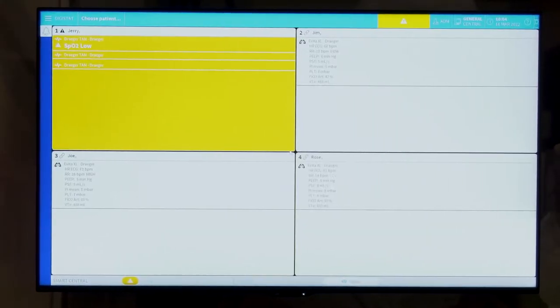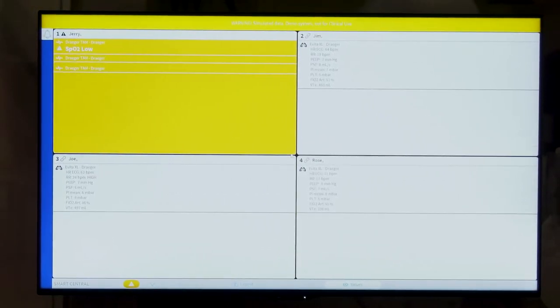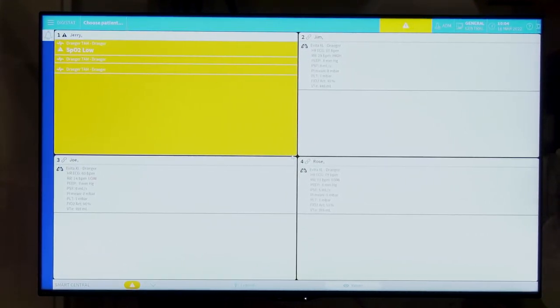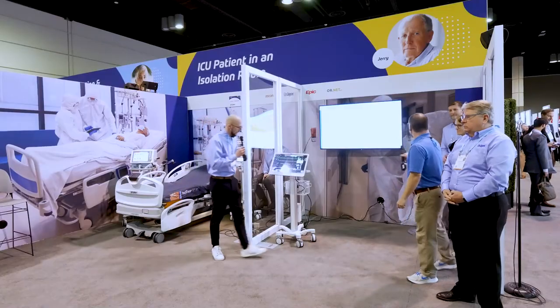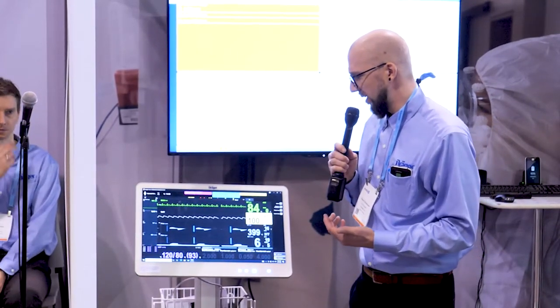In this case, the clinician decides to accept the alarm and take responsibility, proceeding back to the anteroom to check the patient's vitals on the Draeger point-of-care cockpit and visually inspect the patient's condition through the window into the patient room. It looks like everything is under stable conditions — Jerry is pain-free, stress-free, and perhaps the alarm was just a cuff issue. The point-of-care cockpit shows that the alarm limits may be set too narrow for the current situation.